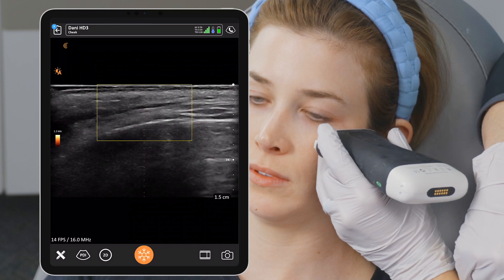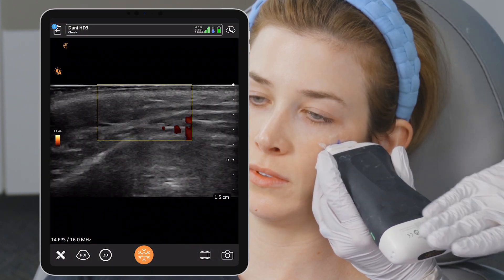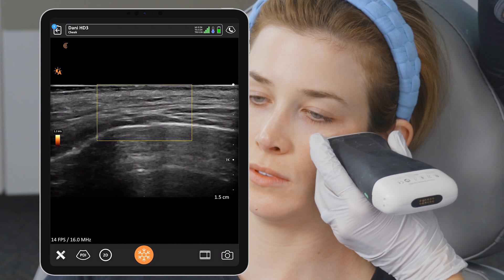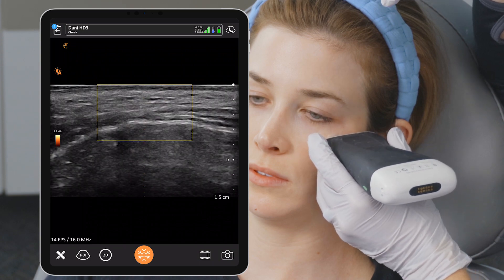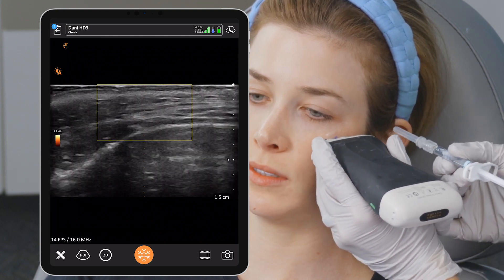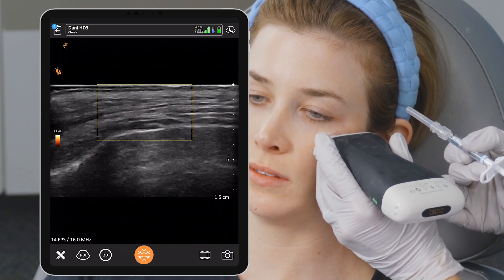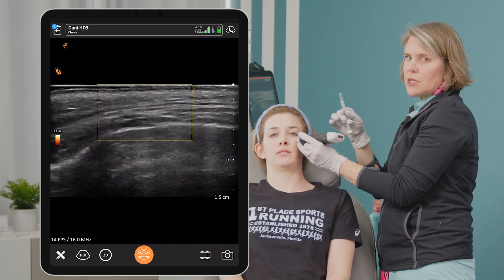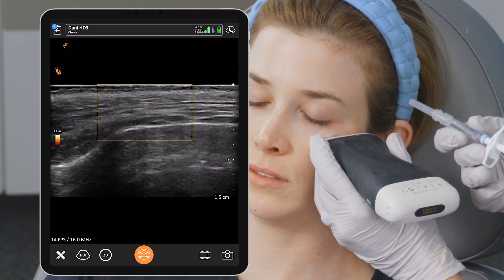Last but not least is your tilt. Your tilt check is going to be the angle at which you're advancing — it's foreshadowing the angle at which you're going to advance your syringe. This way is a different angle than this, which is different than this. You can watch as I tilt down, tilt straight, and tilt up. In this case I'm anticipating my syringe going in this direction. It should be exactly the same angle as your probe, and that's where you're really looking at the screen to see: can I put filler there? Because the angle of incidence is the 90-degree reflection of your sound waves, so the 90-degree reflection is your best view. You want the same exact path that your needle is going to take.